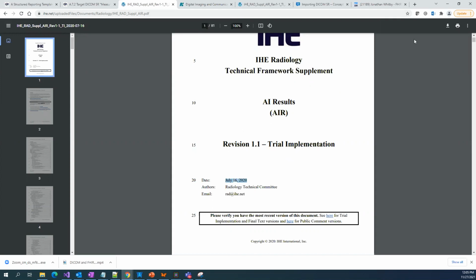He, together with a working group, the FHIR working group, is converting this. They're using TID 1500 and mapping that to FHIR Observation. This is also one of the agenda items in our workflow, where we will review whatever draft has been generated so far, and we'll also give them feedback based on our experience. So it's a work in progress, to answer shortly, Venu.